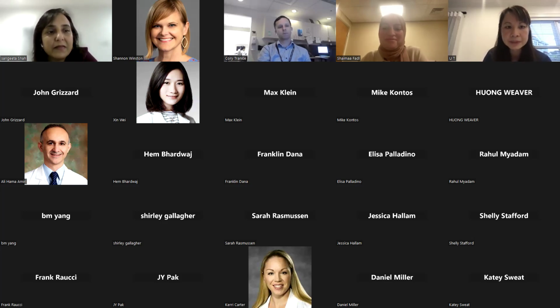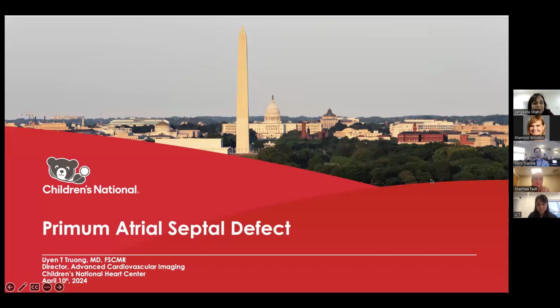So when you're doing TEE to help guide surgery, just be aware that you need to clearly define your atrial septum versus your eustachian valve. That's very helpful. Thank you.